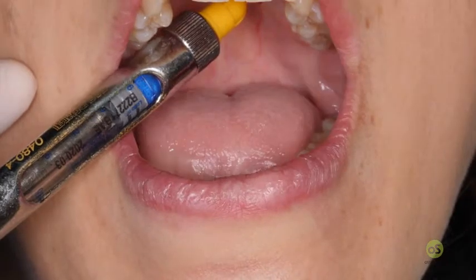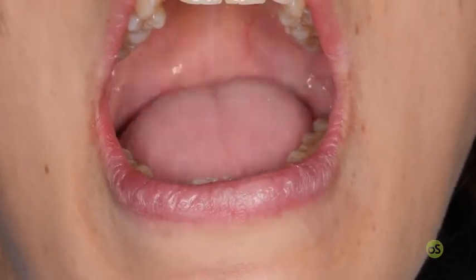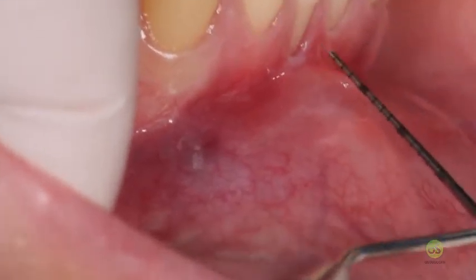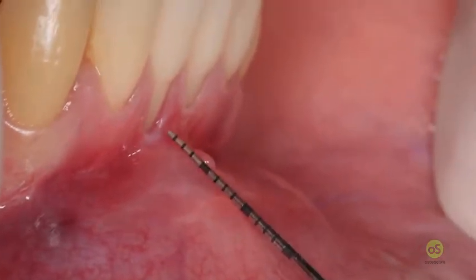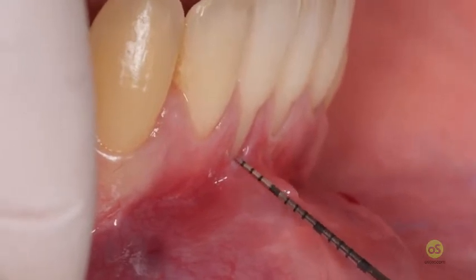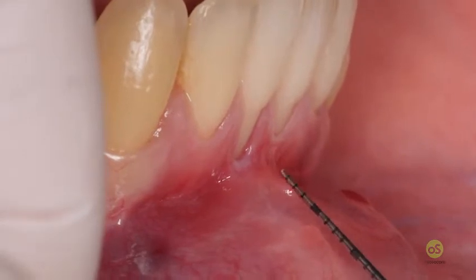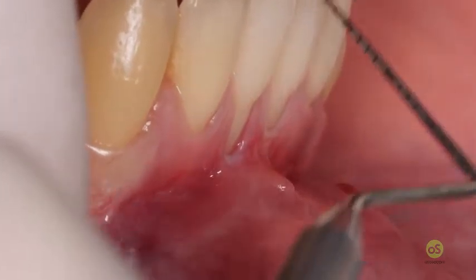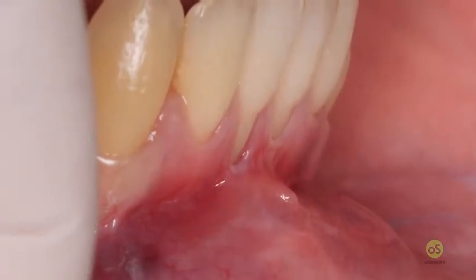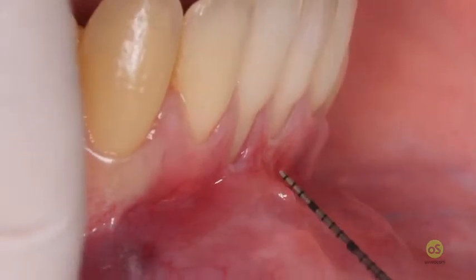Now we have to wait for the anesthesia to spread in the lower incisors, and in the meantime, in terms of vestibulum depth, it is the distance between the lip, that is completely horizontal, and the soft tissue margin. So if you look at the position of the lip, where the lip and the muscles are inserting perpendicular to the root and the soft tissue margin, you can see that the vestibulum depth is really zero in this patient. So we don't have any vestibulum depth.